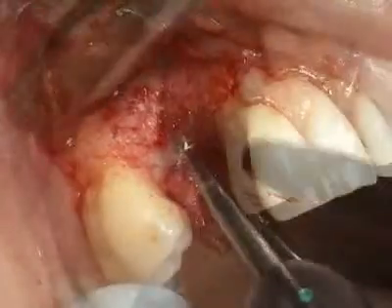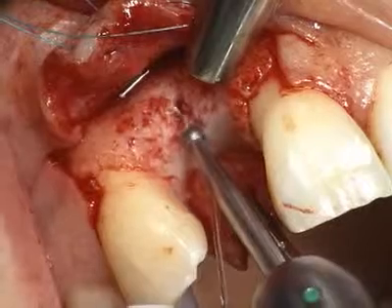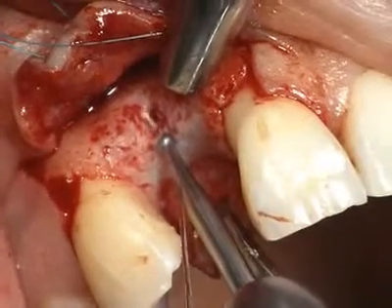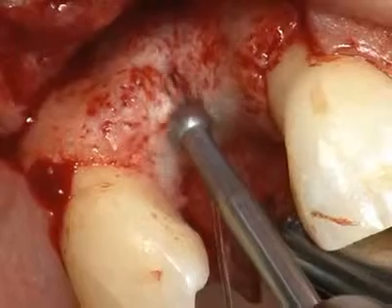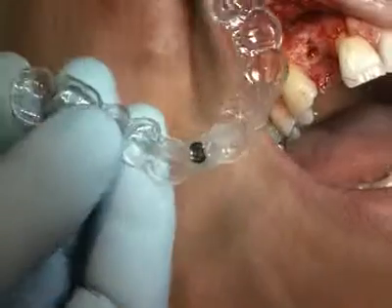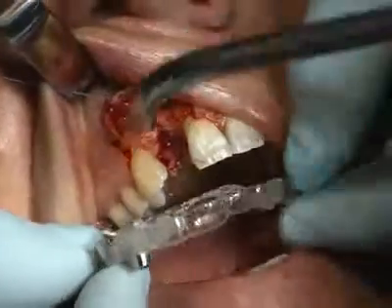This facilitates subsequent positioning of the pilot and twist drills. To achieve implant placement that is exactly in accordance with the planned implant axis, we recommend using a drill template to carry out the initial drilling step.